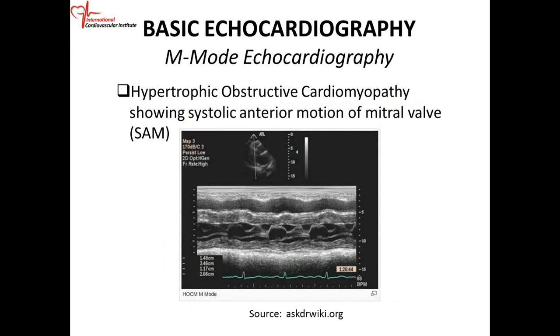Okay, so now this, you're definitely going to get on the exam, so you have to know what it looks like. So all you do, you just work it out. Don't get flustered. That's the worst thing to do, is get flustered. From first principles, your two-dimensional echo is on top.